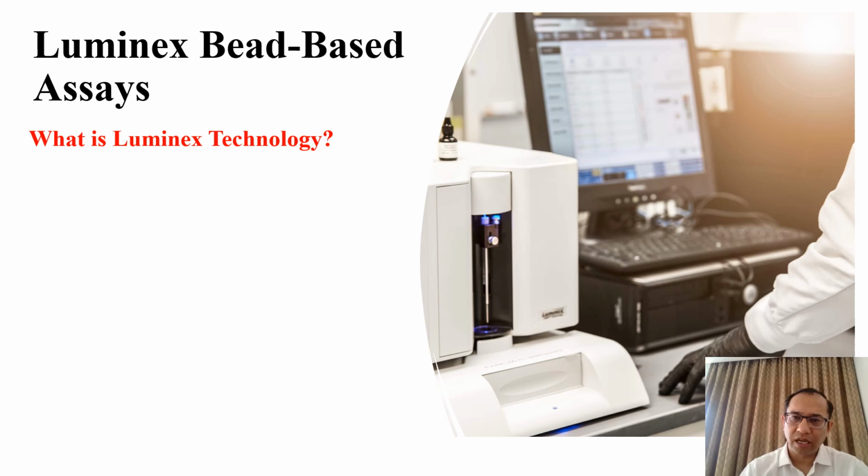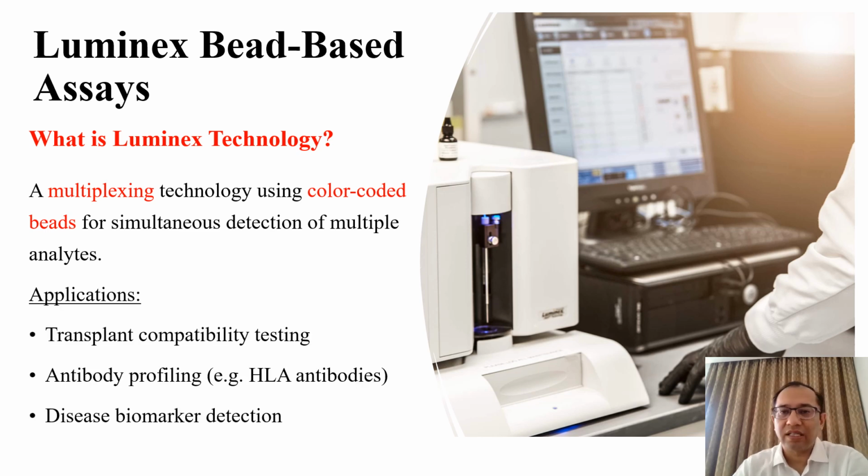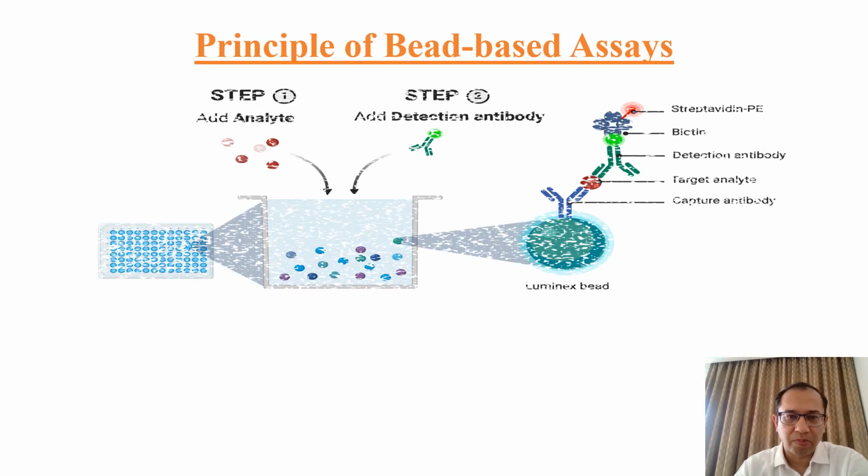So Luminex based bead assay, just a small brief introduction about it. It is a multiplexing technology which has color coded beads for simultaneous detection of multiple analytes. It has an application in transplant compatibility testing, antibody profiling, and disease biomarker detection. So what is the principle?